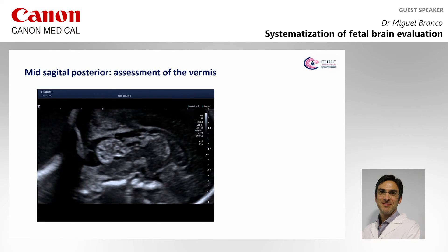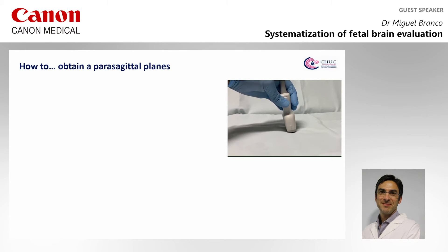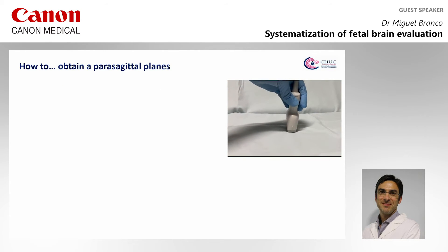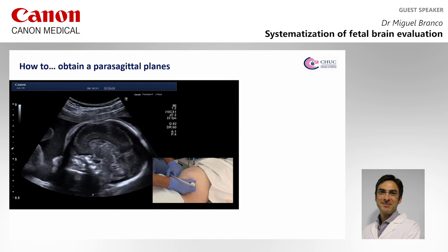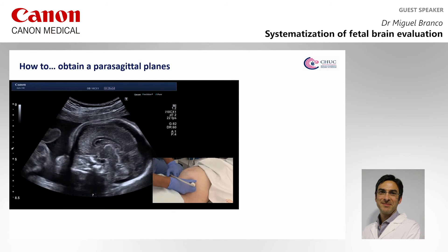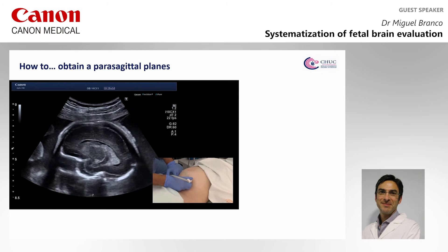Also from the posterior fontanella, we can study the posterior fossa with the vermis, fourth ventricle, and the choroid plexus. If we tilt the probe slightly, we will obtain the perisagittal planes from the sagittal planes.